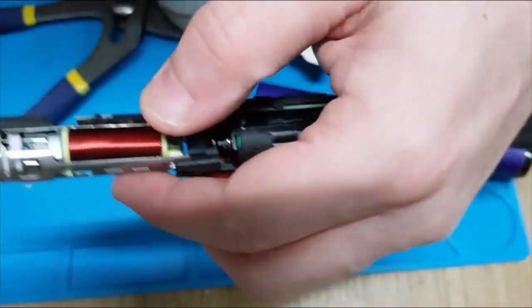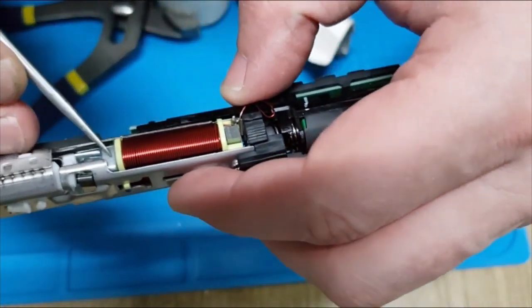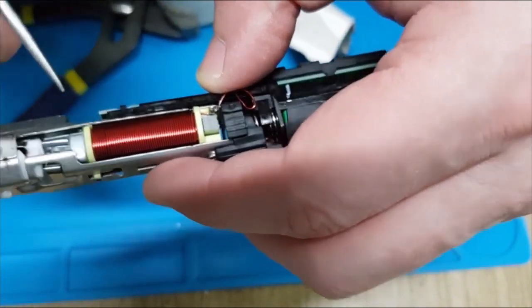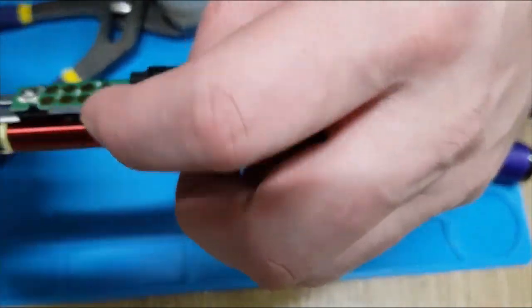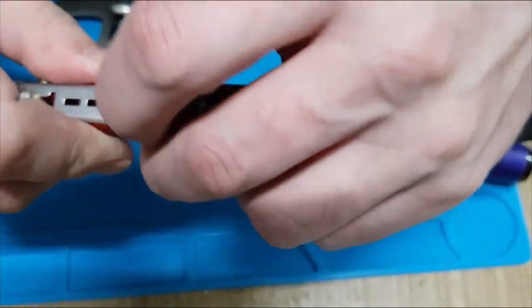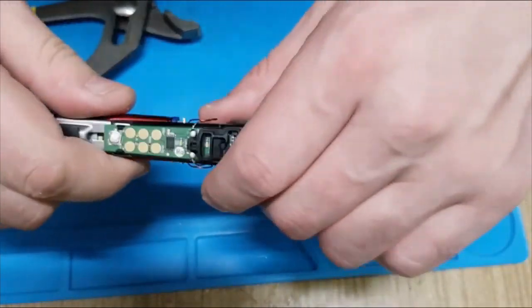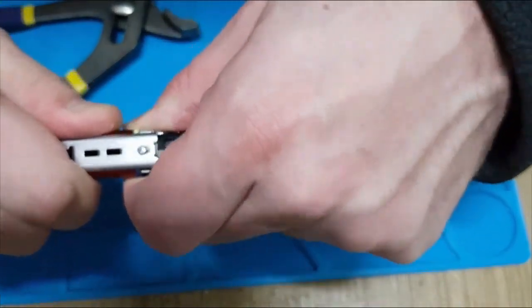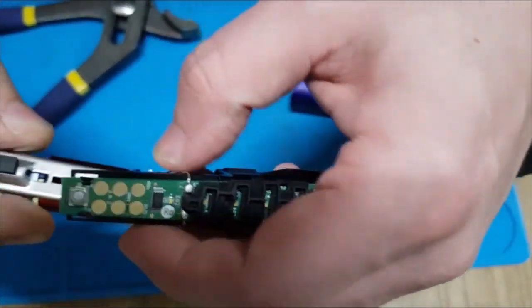So let's see. Yes, as you can see, the magnet is next to the electromagnet, and so no vibrations are being produced. It's quite an easy fix. In principle, you need to just take this one out and slightly bend it and pull it apart. When you pull it apart, you can take it out.